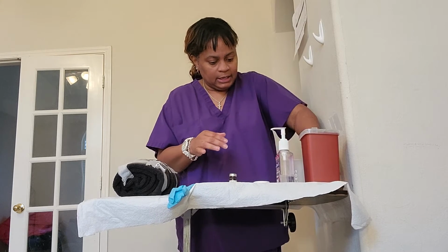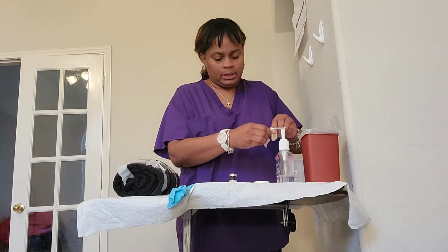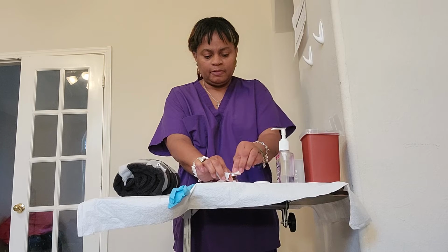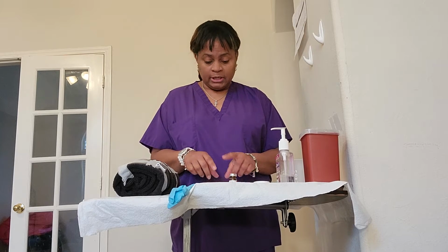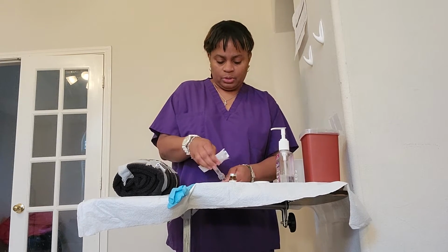Following aseptic technique, I am going to prepare the medication. I take an alcohol pad and I wipe the top of the vial. What I have on my site here is a 23 by 1 inch needle that I'll be drawing up the medication with.